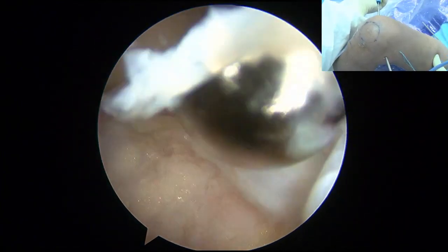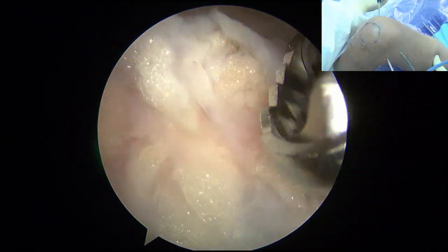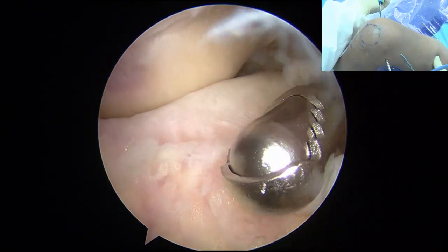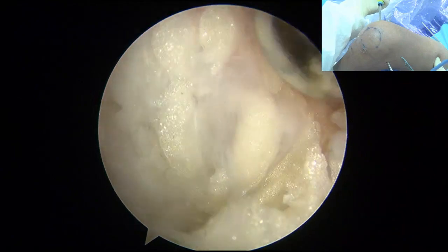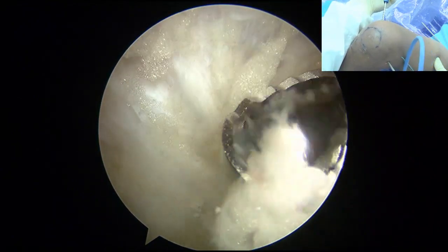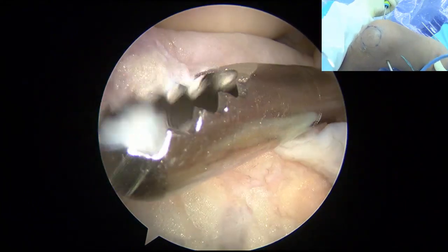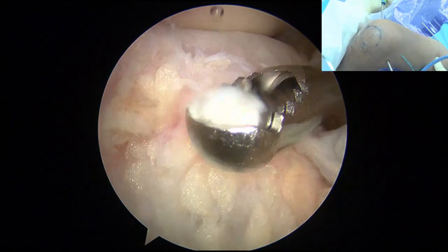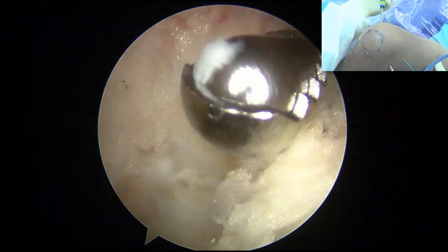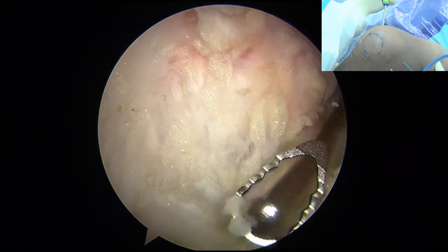Okay, good. So now we follow the track, right? Here, it says follow this. So for the multiple ligament, right? Because in Thailand, we also have no allograft. We did a study for the peroneus longus. We now have nearly 10 years of follow-up of the patients. So I use peroneus longus for multiple ligament reconstruction. Lisa, please translate. Yeah, I got it.